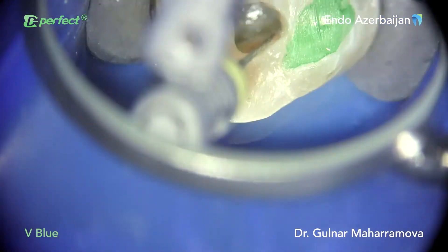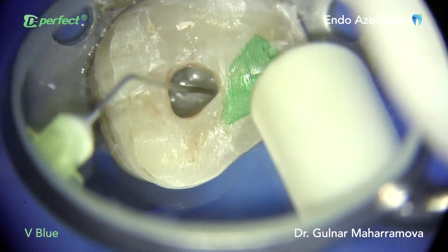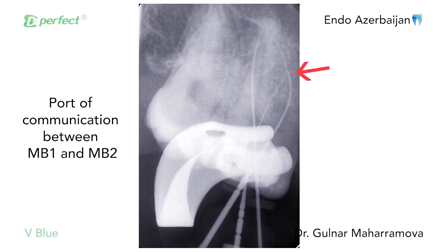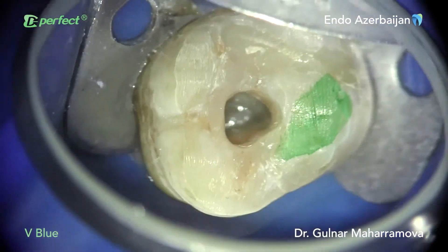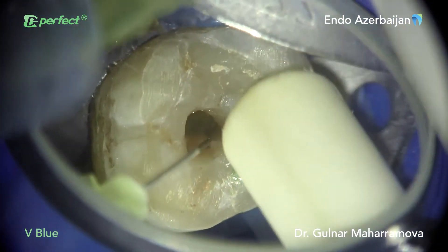The canal was narrow and curved. Sea pilot files were used to reach working length and to establish a glide path. Each file was followed by copious irrigation with sodium hypochlorite. Periapical X-ray with files placed in MB1 and MB2 showed merging canals, so the aim was to shape MB2 to the junction point.